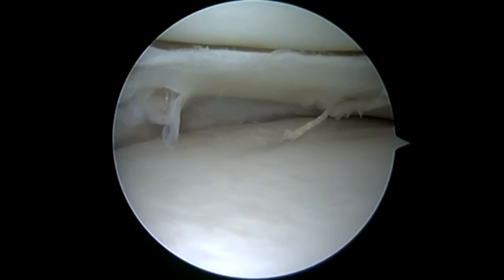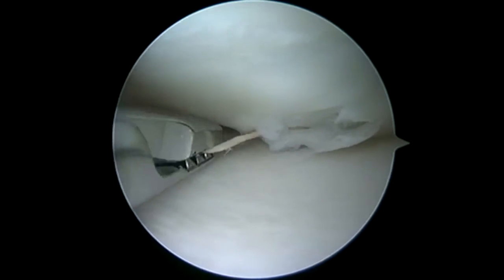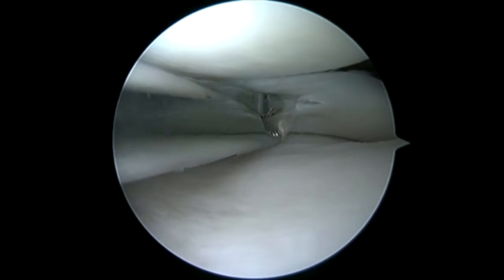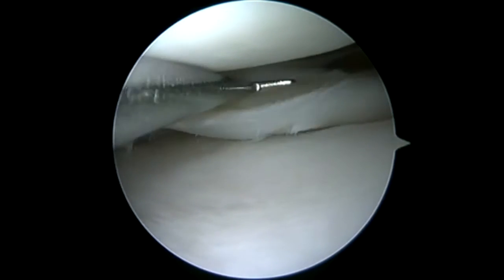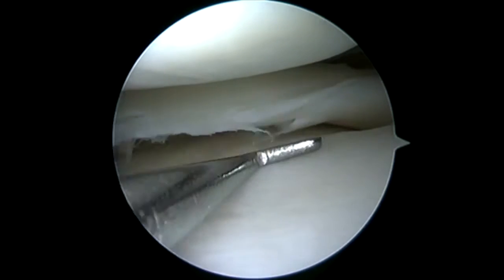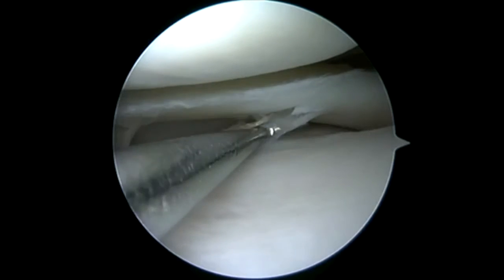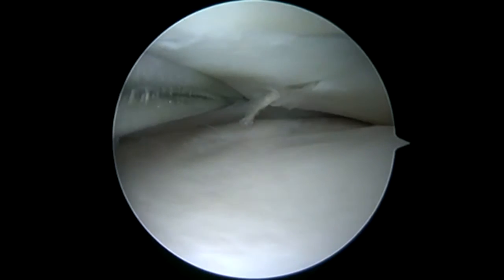For the second one that's stuck right at the meniscal capsular junction, I'm just going to push it back into the Baker's cyst. Afterwards, we're just going to go ahead and repair. I'm pulling, but I'd destroy that meniscus pulling hard, so instead I'll just push it out the back. They're really firm when you get a hold of them — you can feel it, and you can just push it right through the meniscus. Once you start probing that meniscal contour, that hard stop is gone. You know you've got it out the back of the meniscus and through the capsule.